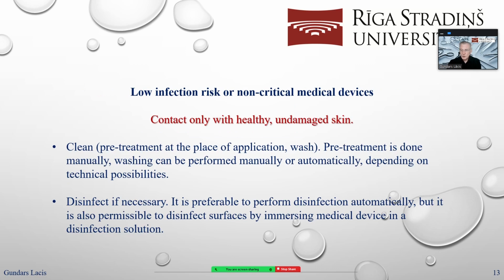Low infection risk or non-critical medical devices. Definition: it's medical devices or instruments which contact only with healthy undamaged skin. And what we have to do with this? Cleaning, it means pre-treatment. Always it will be really nice that it will be done at the place of application, and washing.